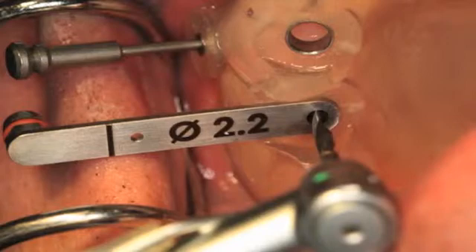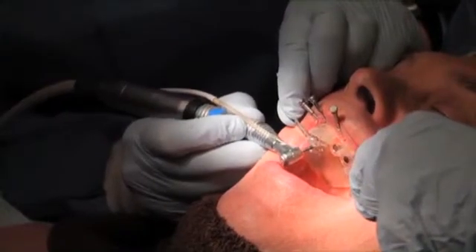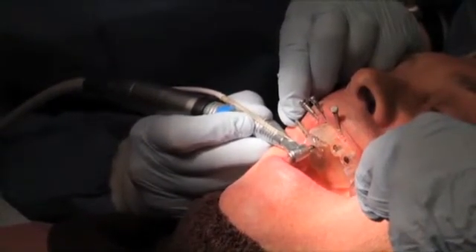Figure 11 and Video 2 show a guiding sleeve placed into the original sleeve for the 2.2 diameter pilot drill. The 2.2 pilot drill key is used to position that 2.2 pilot drill. This allows for accurate angulation and depth, which is critical with using this primary drill.